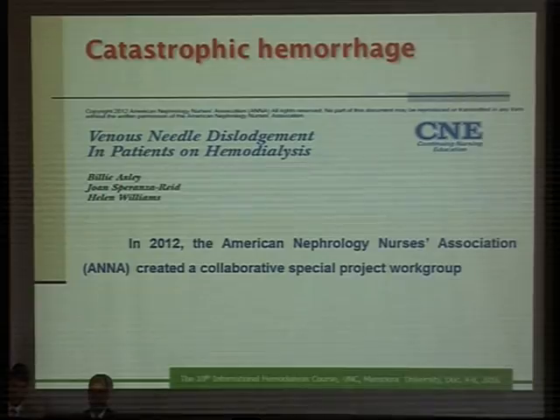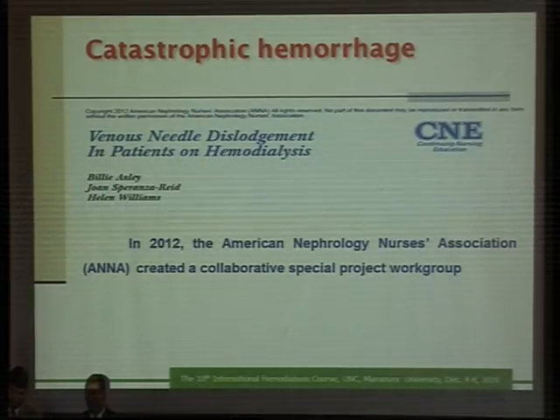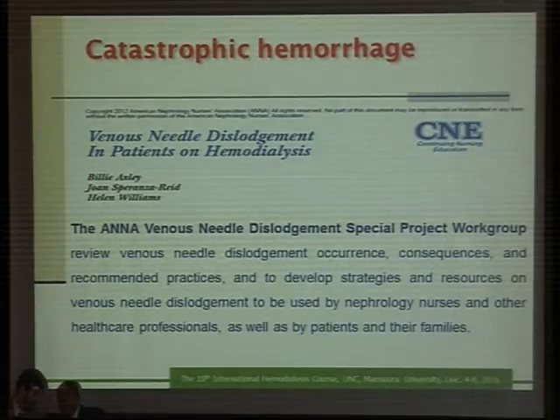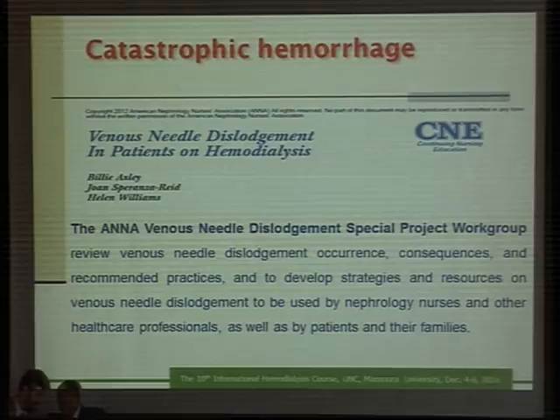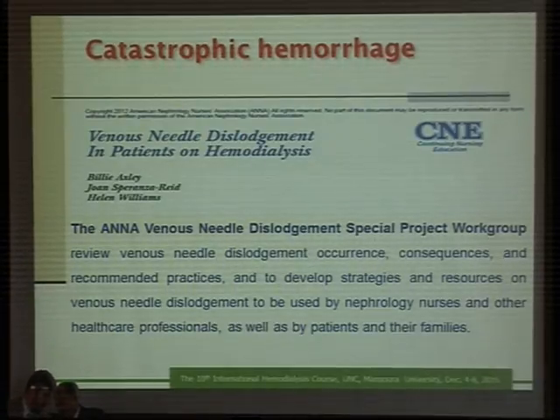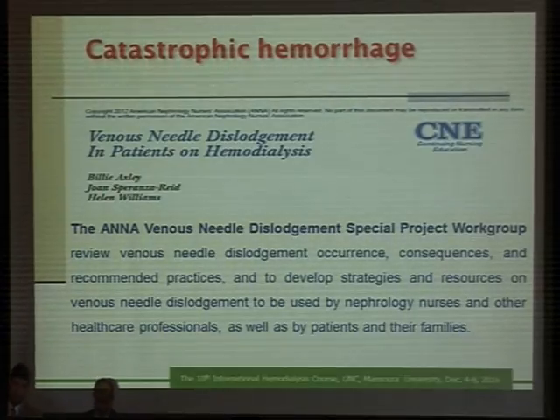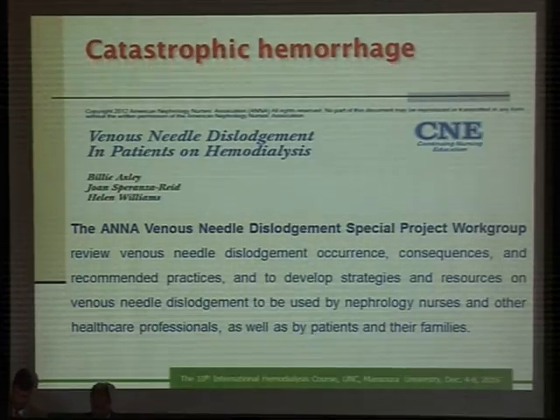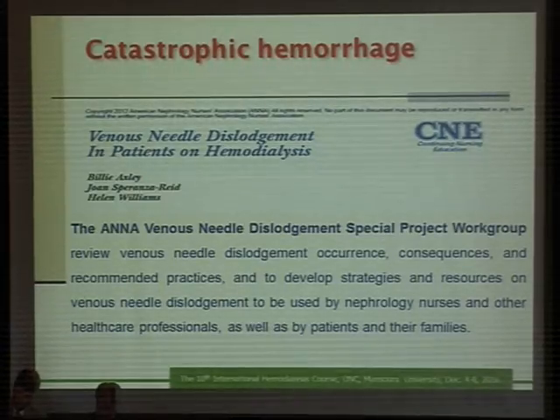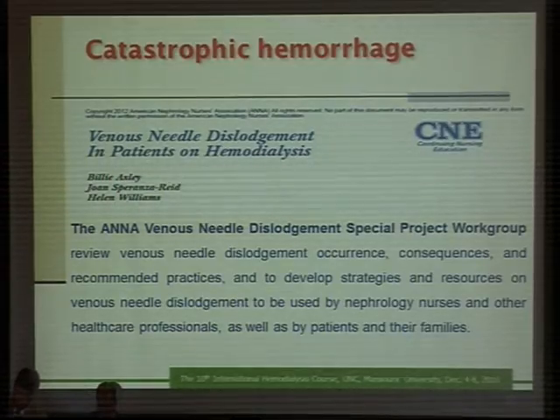That's why a group was created called the Venous Needle Dislodgement Special Project Workgroup. This work group reviewed the incidence of venous dislodgement and their consequences, and they recommended some guidelines to prevent this catastrophic complication.